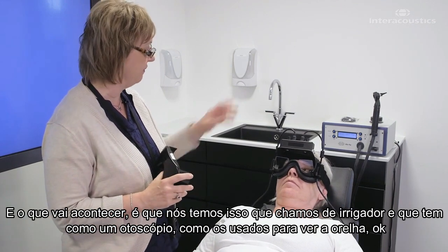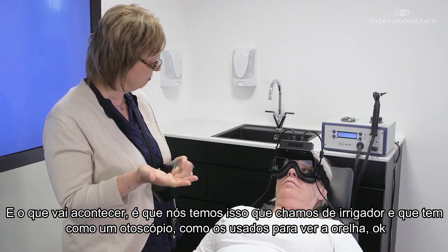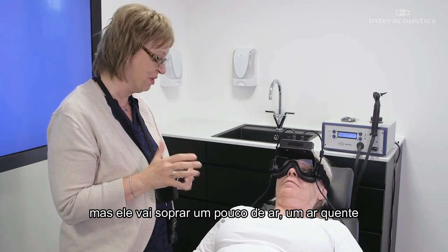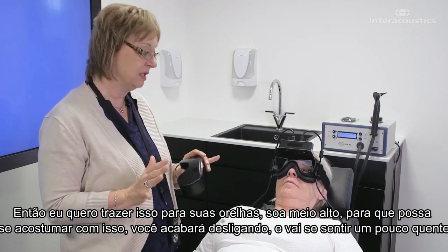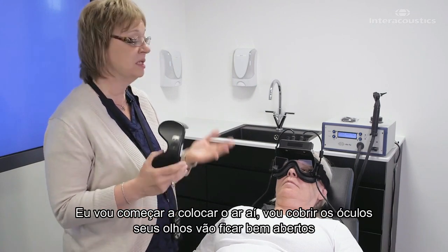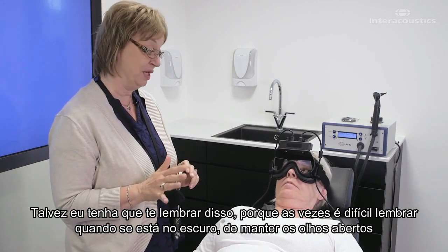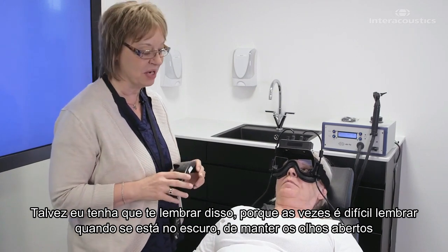What's going to happen is I have this — it's called an aerogator — behind me, and it has an otoscope like what the doctor looks at in your ear with, but it's going to be blowing some air. It's kind of warm air. So I'm going to bring that into your ear. It sounds kind of loud, so you can get used to that. You'll eventually tune that out, and it's going to feel a little bit warm.